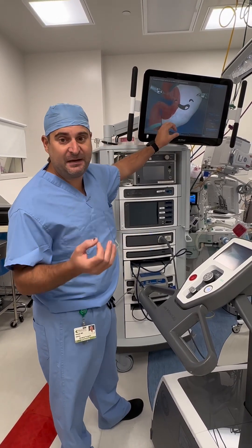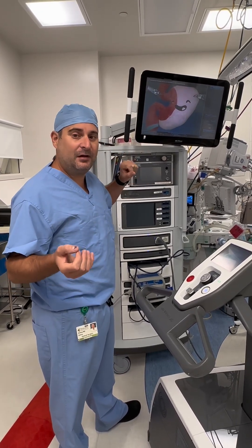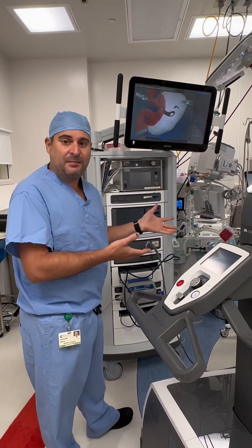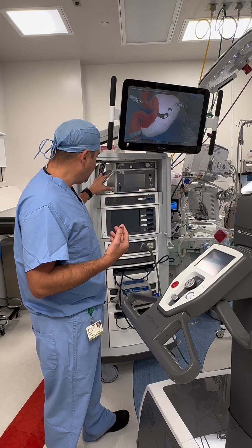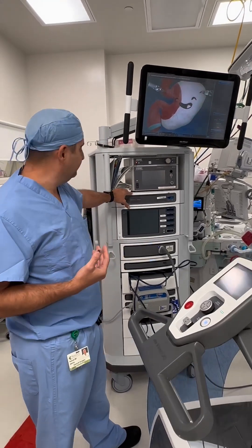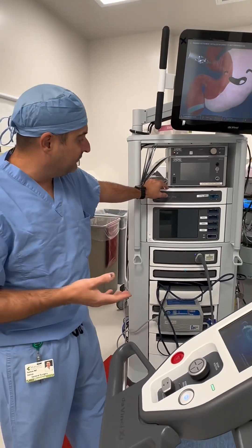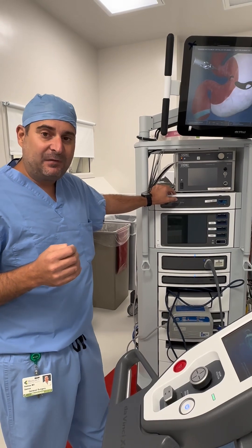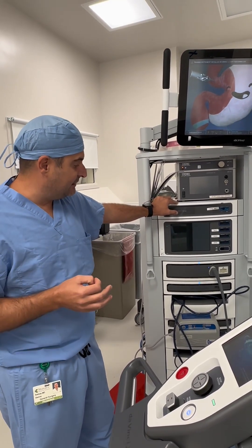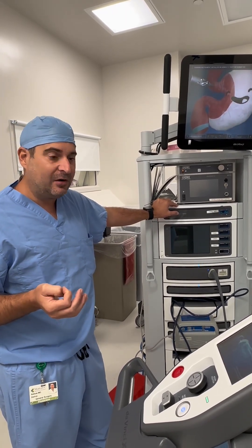There are also speakers and a microphone attached to this system so I can hear what's going on with the patient, and people in the OR can listen to me as a surgeon. There are also different components here, including the energy device that helps with different instruments, allowing us to coagulate different vessels and use scissors to achieve what we call hemostasis and decrease blood loss.